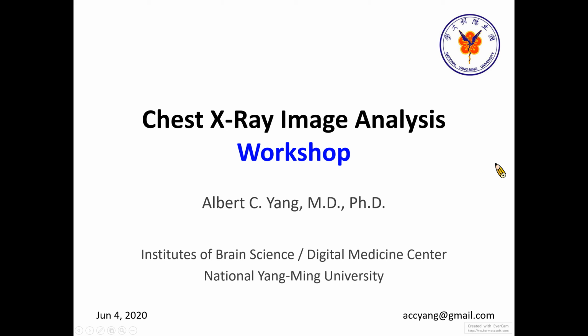In this workshop, I will also provide you a smaller scale pneumonia data set for you to learn how deep learning can help detect pneumonia.